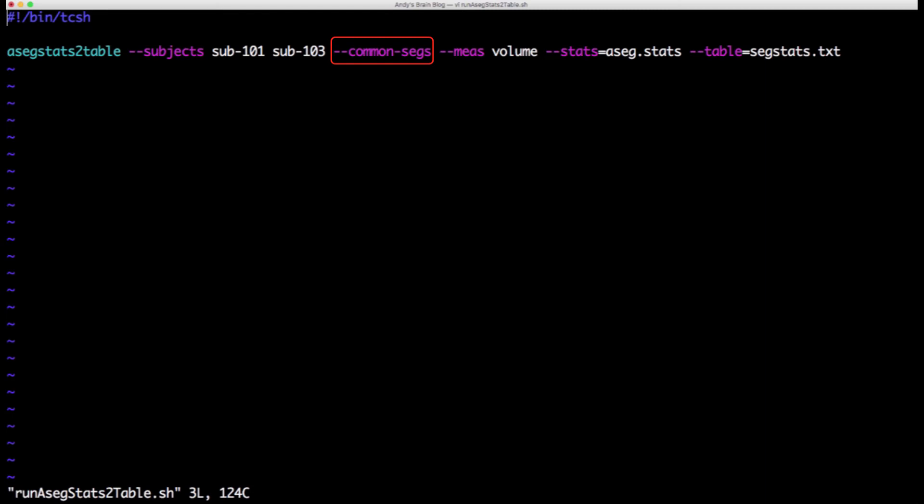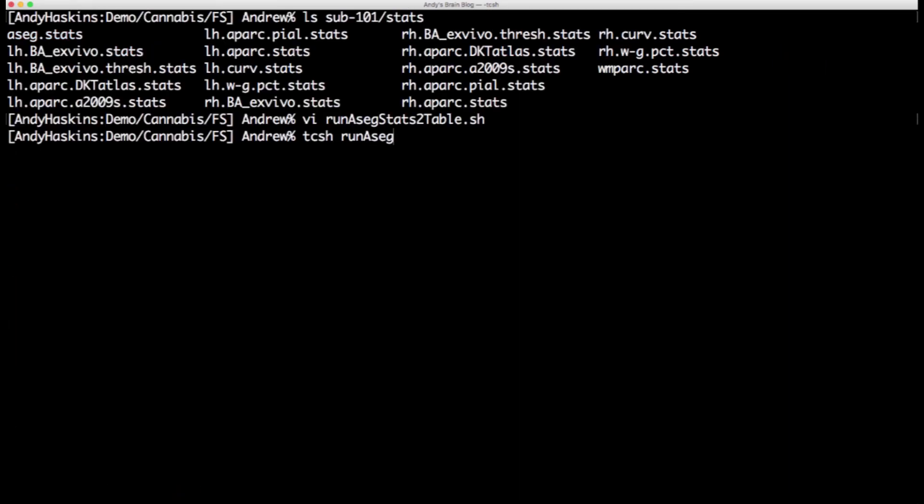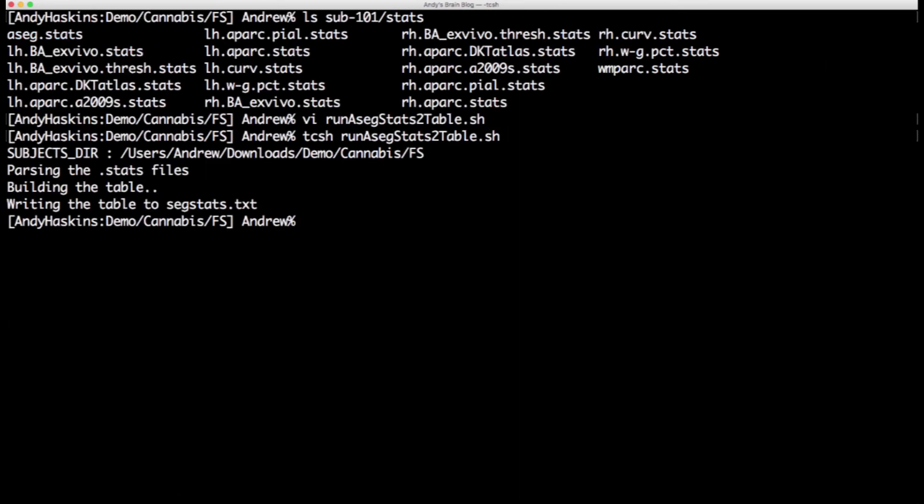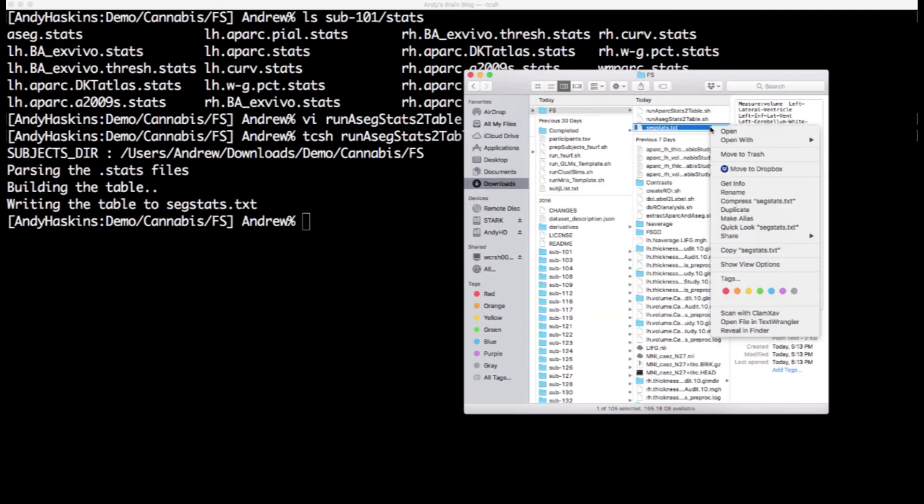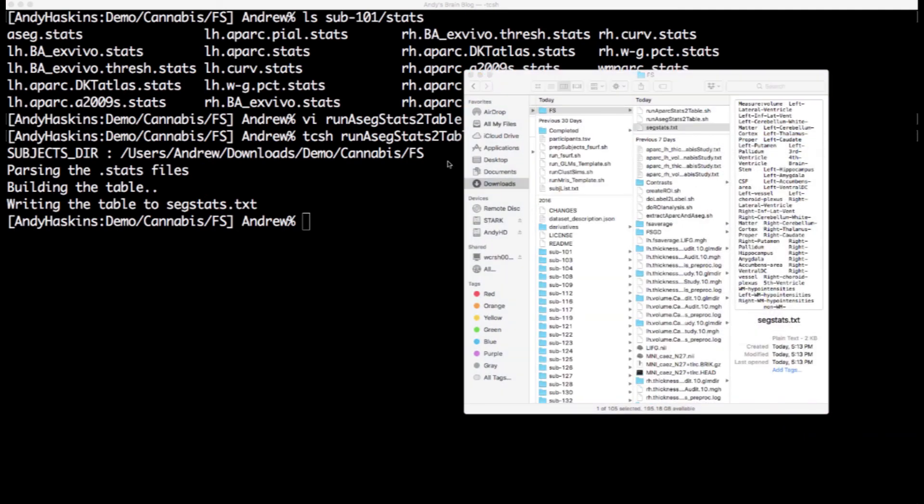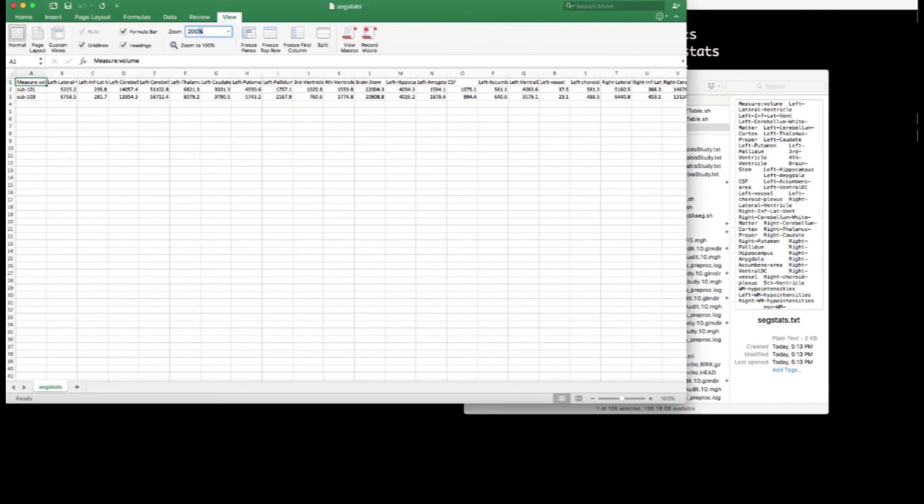The common segs option will run the command even if every subject doesn't have all of the segmentations. This is useful if there are one or two subjects who did not have a particular segmentation and if you don't care about that segmentation. You can open up the resulting spreadsheet and organize it however you want.